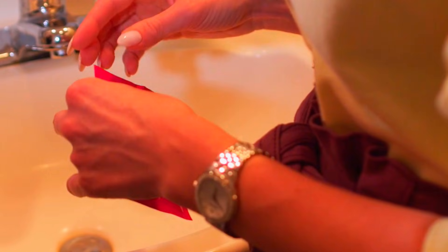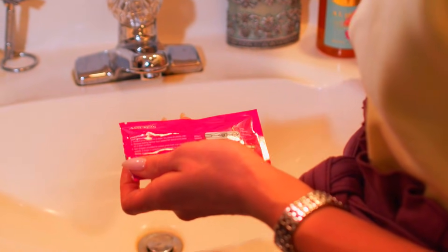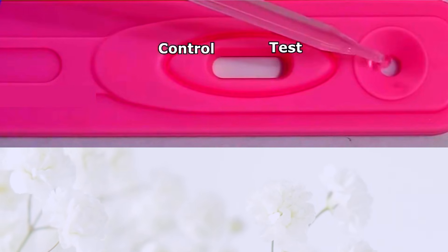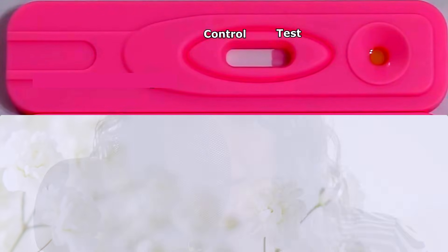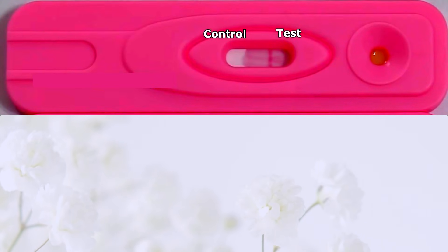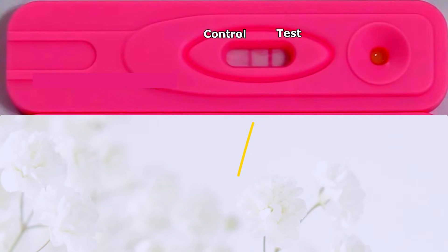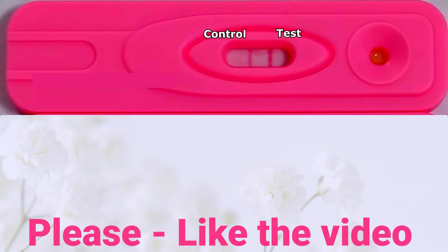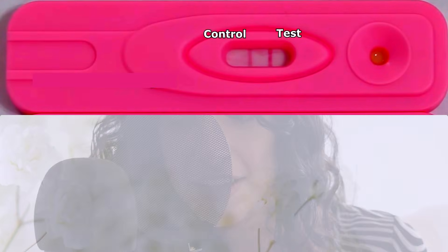Now let's begin the test. Step 1: make sure the test strip is not expired and read the specific instructions on the package. Step 2: open the strip and place it on a flat surface. Step 3: take a urine sample with the dropper and add three drops to the designated area. Step 4: wait for around 2 to 3 minutes, but not more than 5 minutes — check the strip's notes for exact timing. The strip has two areas where lines may appear: the control area and the test area. The control line becomes visible regardless of pregnancy, confirming the test is working properly. The test line will appear if you're pregnant and your HCG hormone levels are elevated. To test positive, which confirms that you are pregnant, both the control and test lines should be visible. Most tests show results in about two minutes — always check within the recommended time frame.